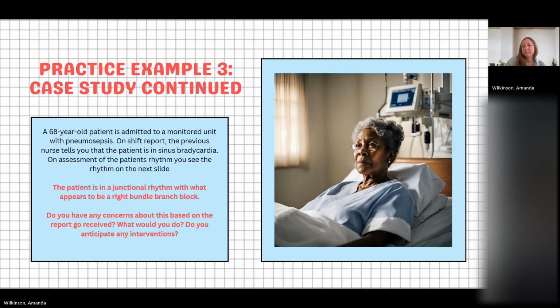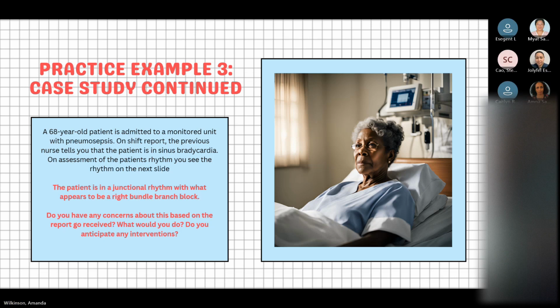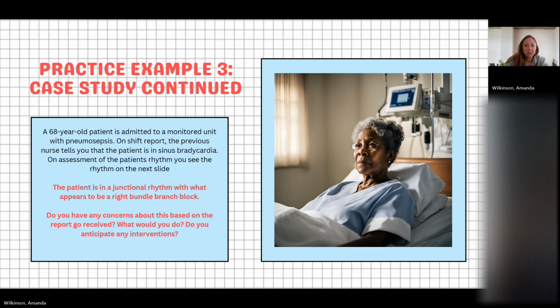So what would you do next with this patient? Notify MD of the new finding. 12 lead, great. One second, let me just plug it in my laptop. Okay. Inform MD, yeah.